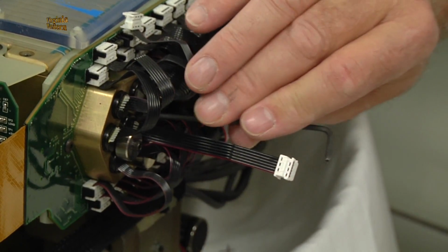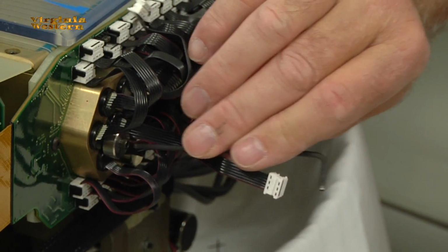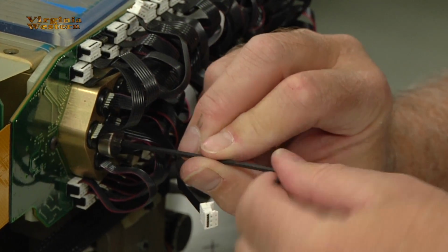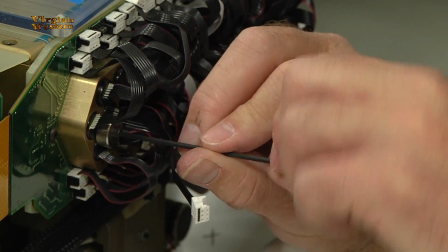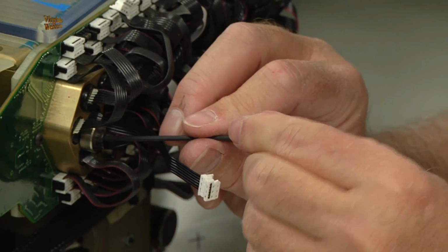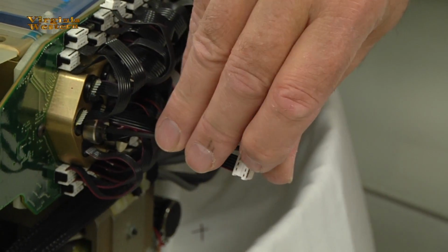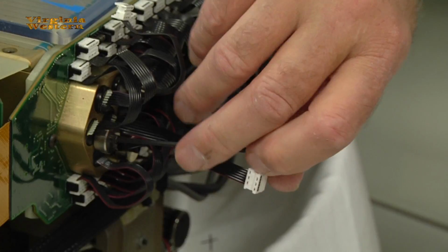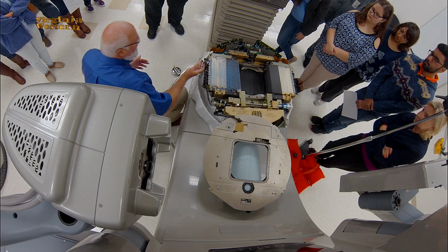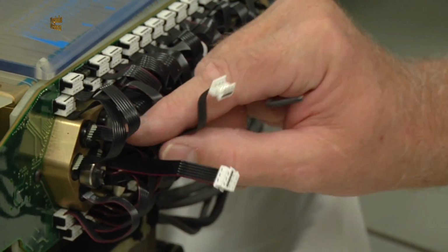And beforehand, you might want to just push gently on the back. And you adjust it till it's snug, not over tight. You'll break the screw. They're not very big. So there's that one. Now I have two motors off, and I might not know which one goes where.